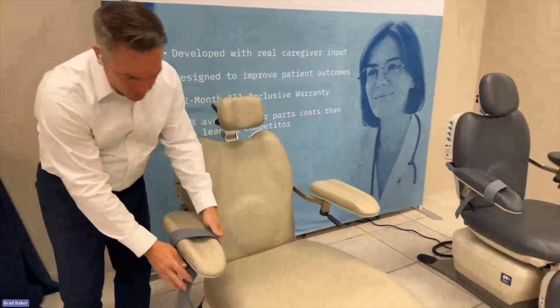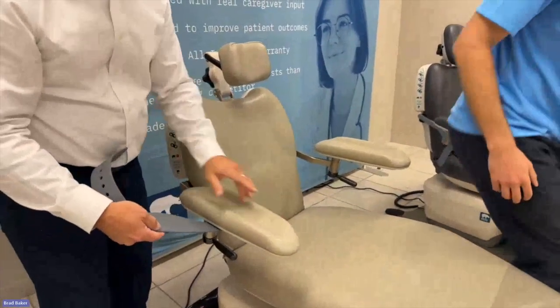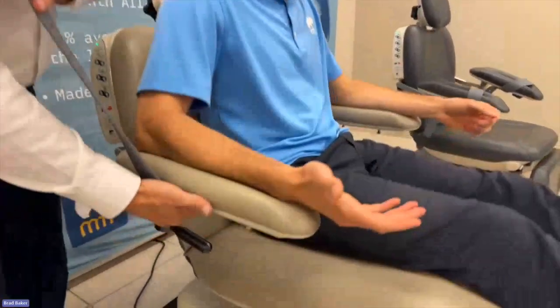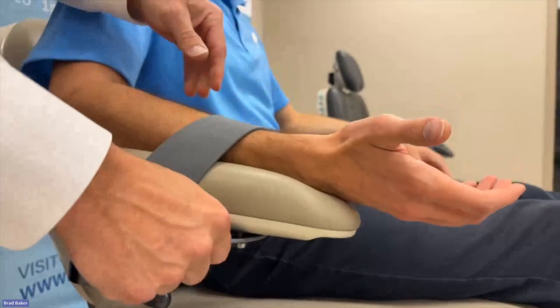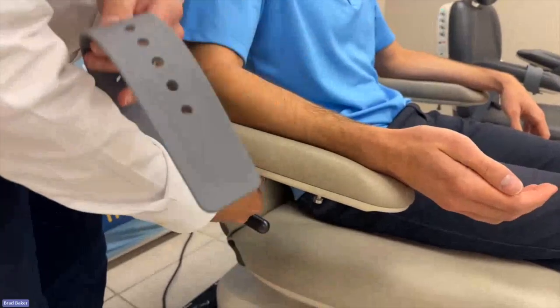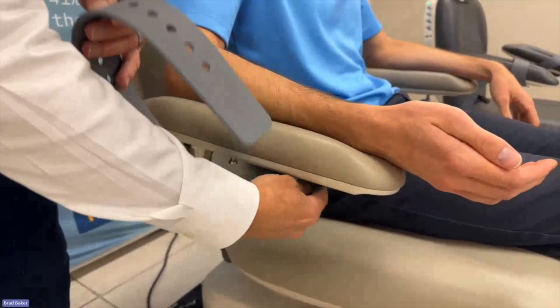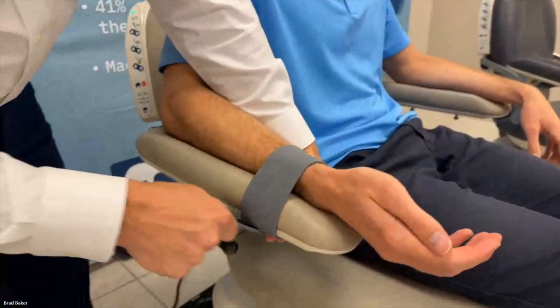With these new arms, they come standard with the arm straps. There's actually 2 positions where you can mount it to, and thanks for sitting down for me. You can either come from the lower back post and wrap around the front like this and tighten it, okay? If you want to more lock in the wrist, we can move the strap to the front mount right here. And so now it's on the front wrap, and it allows me to capture the wrist a lot better when you do that.